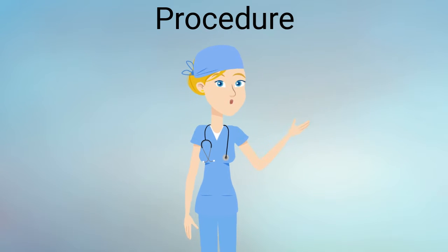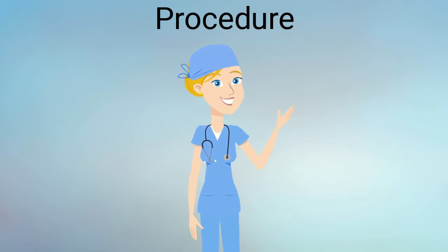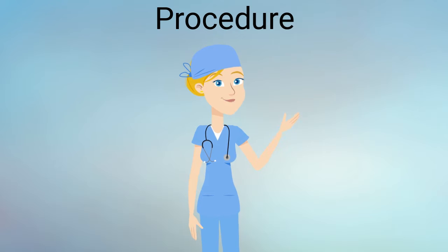At this point during the procedure, your doctor will make the decision if any narrowing or blockages in your arteries require stenting. Your physician may take measurements of the pressures in your heart chambers or even take a biopsy of the tissue if medically necessary.